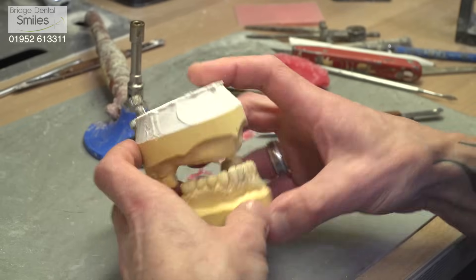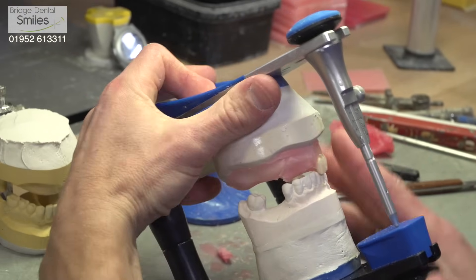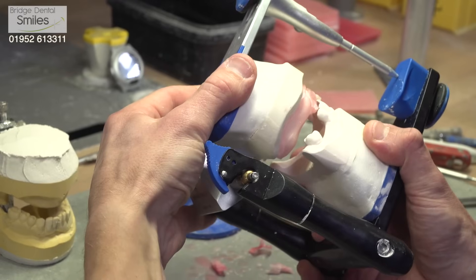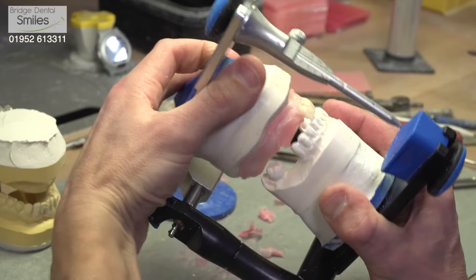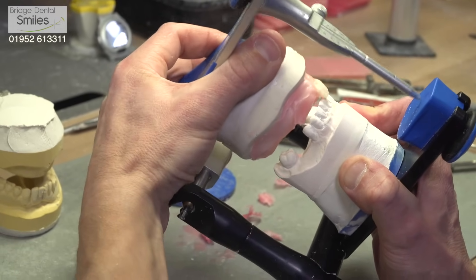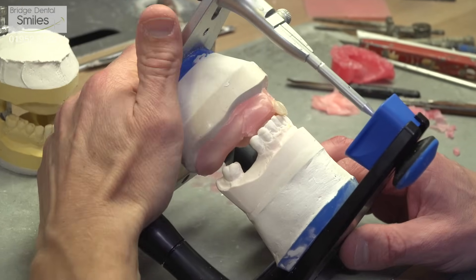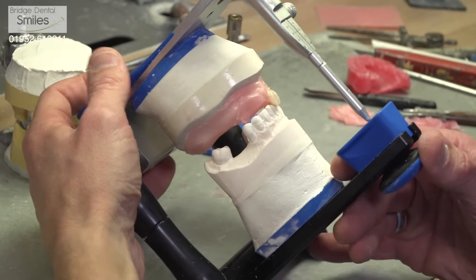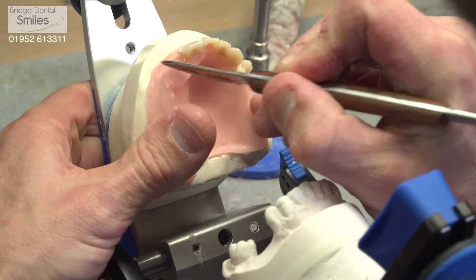If we move across to the next articulator, as well as going up and down like the simple hinge, this articulator has a sliding function at the back. That enables us to create a greater range of movement with the teeth, which leads to less interference and less problems with the finished denture. Normally we'd use the more complex articulator on private cases and the simple hinge articulator on NHS cases. Ultimately we get better results from the more complex articulator, but it does take longer — and that's why there's a cost.